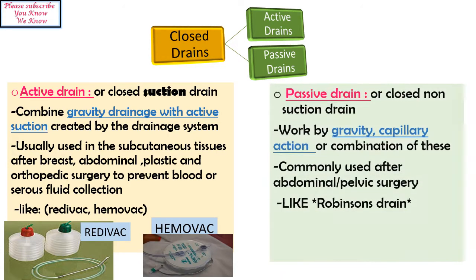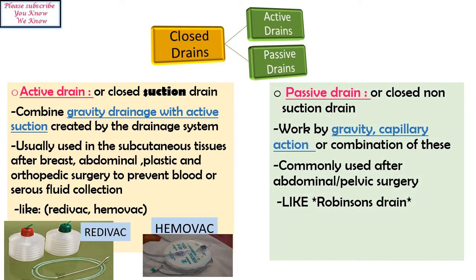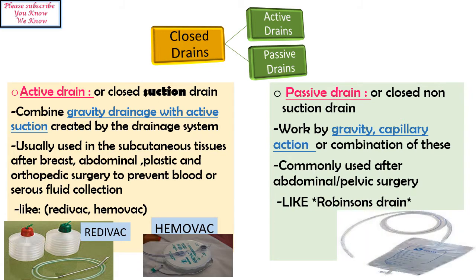Whereas the passive drains, or the closed non-suction drains, work by gravity, capillary action or a combination of these. Commonly used after abdominal or pelvic surgery. Examples such as Robinson's drain.